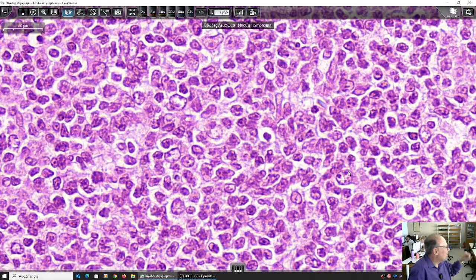Okay. So, our markers. CD3, this is a T cell marker. It will have nothing to do with these lymphoid follicles. CD10, CD19 and 20, yes, because they're of B cell. Okay? Now, a marker that is consistent with the blockage of apoptosis and which will help us differentiate the lymphomatous lymphoid follicles from the reactive lymphoid follicles.